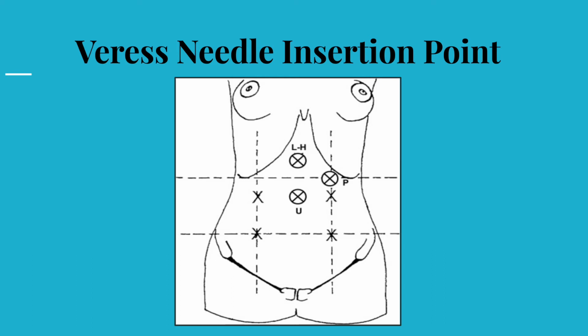Moreover, patients that have previous abdominal surgery will also benefit from Palmer's point insertion, as previous abdominal surgery has a higher adhesion formation risk and also carries an increased risk of visceral injury. Hence, the Palmer's point will ensure a safe entry.